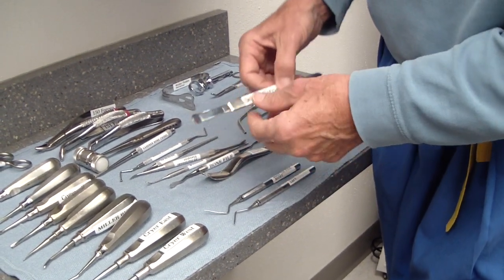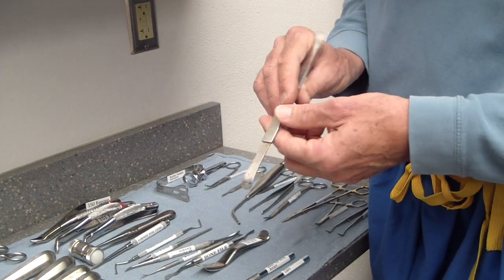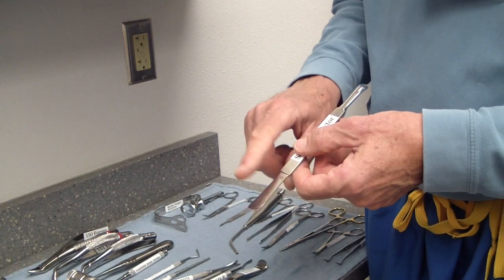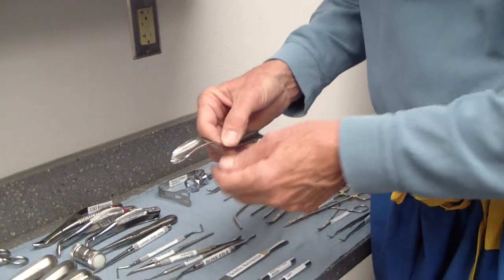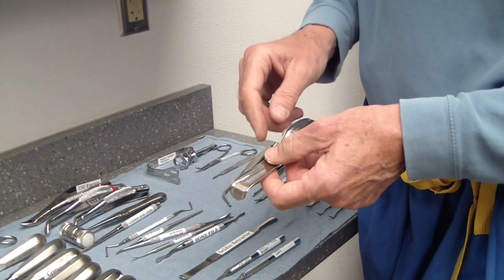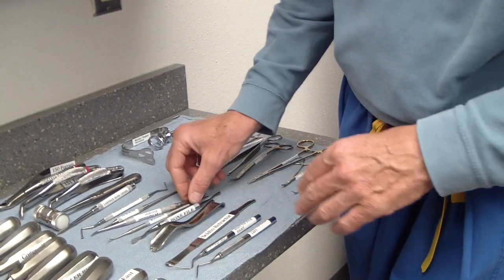The Seldin retractor is one I use quite a bit for retracting gingival tissue out of the way. It doesn't stretch the patient's mouth out as much and you can get back in there — but watch carefully when using your bur because it can rub against it. For that reason many people use the Minnesota retractor, which is wider and retracts more tissue. It's a little safer with the bur, but it does stretch the mouth more and can be uncomfortable. Use whatever works best in your hands.